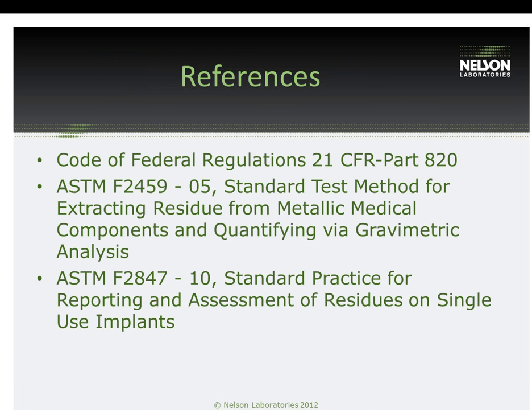And to list out some of the important references that we discussed today, the first is the GMP requirement that talks about why you have to do these cleaning validations for manufacturers. The second, ASTM 2459, is the test method for the gravimetric extractable residue test, that test having its own separate standard. And the third and final standard listed on this slide, 2847, is the overall cleaning standard that discusses these cleaning validations as a whole and the test options available.